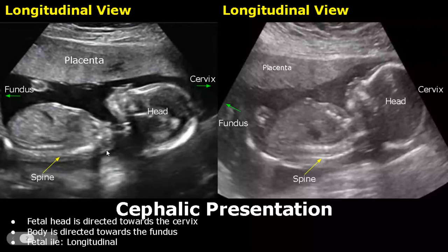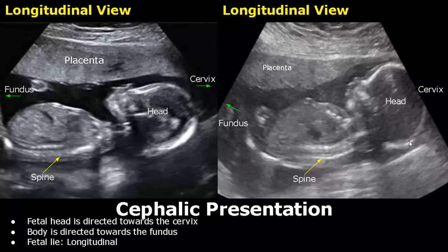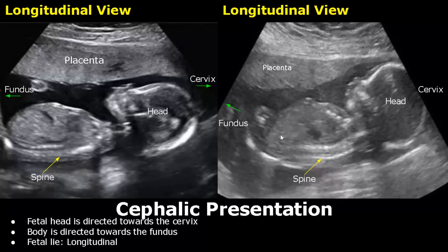Fetal presentation can be seen in a longitudinal view. The cephalic presentation is the most common and an ideal presentation for normal delivery. The fetal head is directed towards the cervix and will be seen on the right side of the image. The fetal body is directed towards the fundus, that is the upper part of the uterus, and is seen on the left side of the image in a longitudinal view.